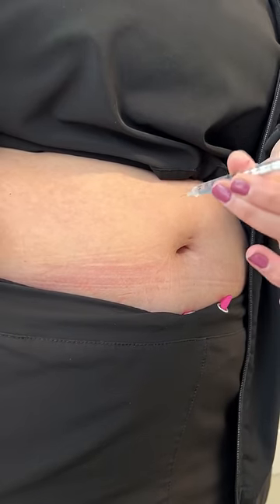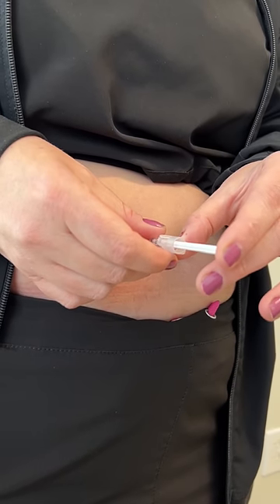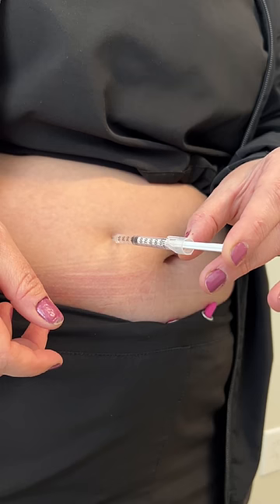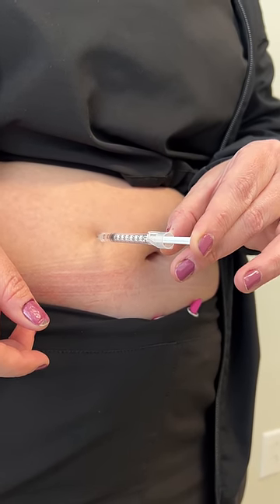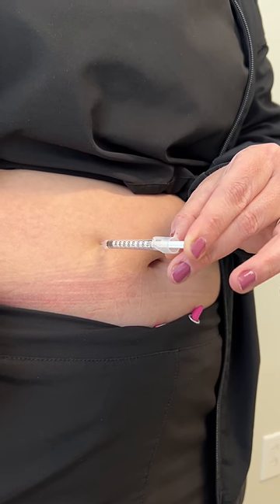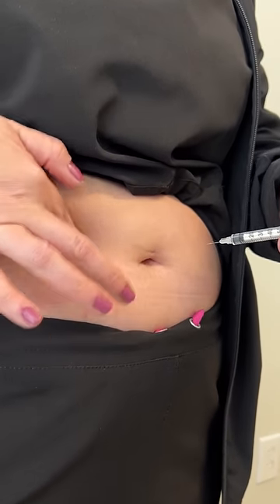Now it's time to inject into the area. We can do the abdomen about two inches away from the belly button. You can also inject the back of the arms or the thighs, as long as it's in the subcutaneous tissue. You don't need a band-aid for this — there is no bleeding and it is very minimal pain. Just insert the needle pretty quickly into the tissue and we're all done. Please reach out if you have any questions.